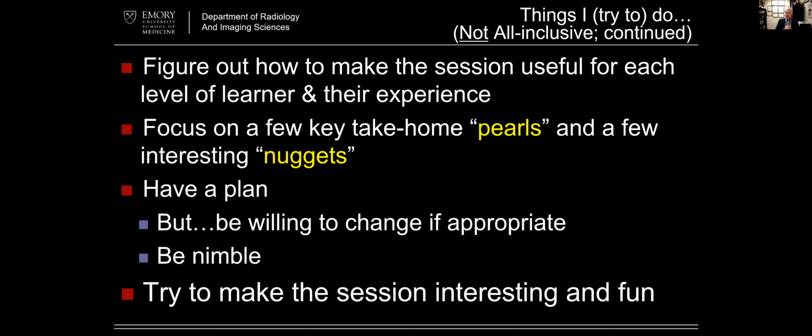So when you approach things like teaching at the PACS, of course, you want to have a plan, but be willing to modify that plan if appropriate. And then, be nimble, be able to evolve and learn from the process and learn from the feedback. And even in the same session, it may evolve, like, okay, this person I'm reading out with really knows all of this kind of stuff. So you're just trying to figure out where the holes are in their knowledge and fill those holes. Or maybe I need to backtrack here and go back to first principles and really basics. There's that part and everything in between.